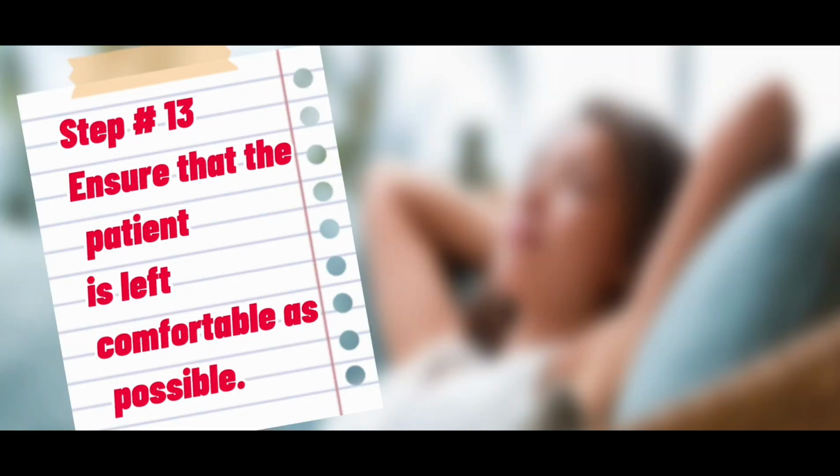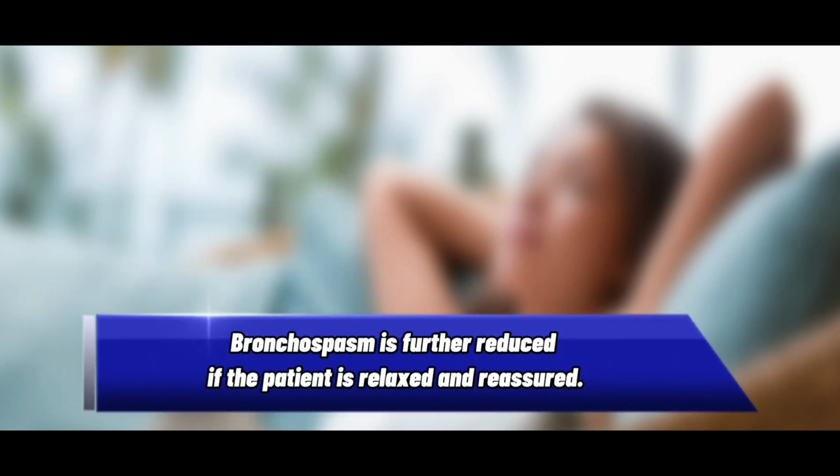Step number 13. Ensure that the patient is left comfortable as possible. Bronchospasm is further reduced if the patient is relaxed and reassured.